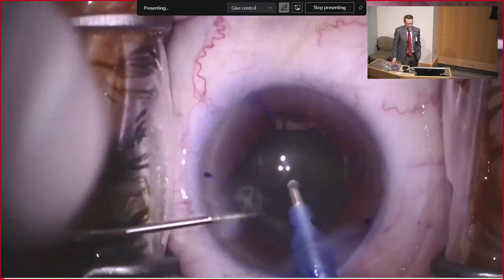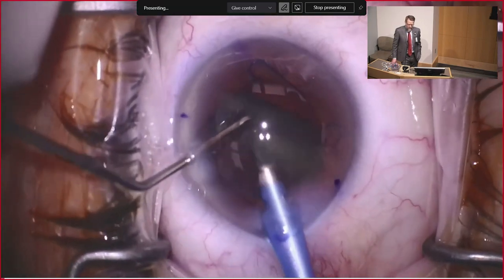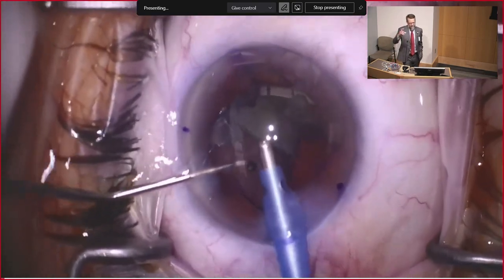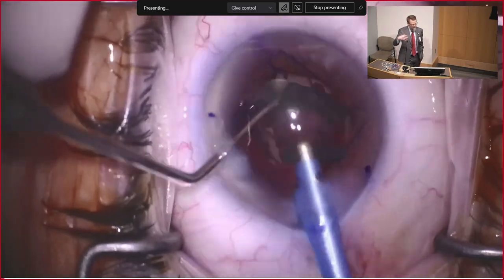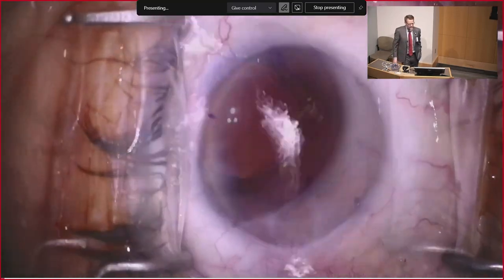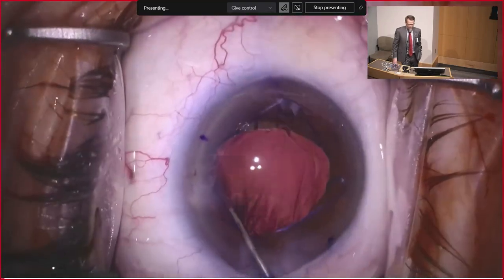Is it a single vacuum? You don't adjust the vacuum in this, I'm assuming. You don't. The only thing you can vary is the finger hand position, and it does increase in what I'm going to call its rate of aspiration rather than vacuum, the way we think about it with a peristaltic pump. Do we know what that vacuum is full on? How much have they measured that? We are finding that out.